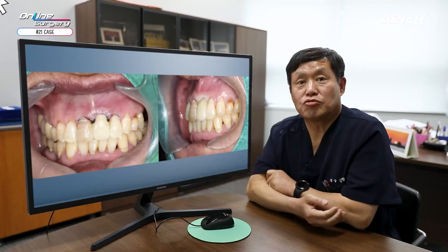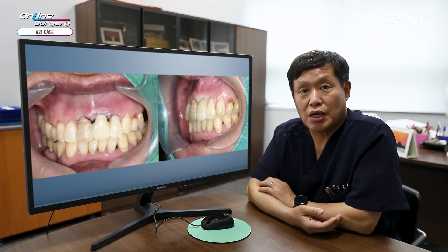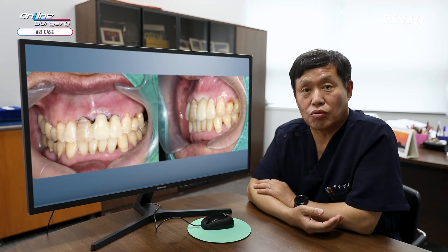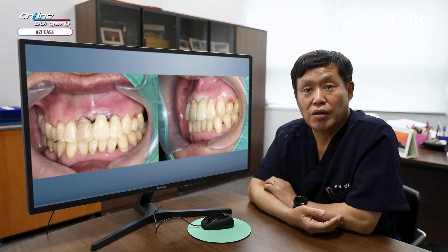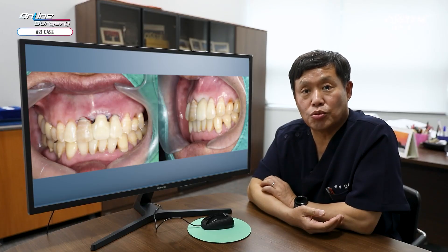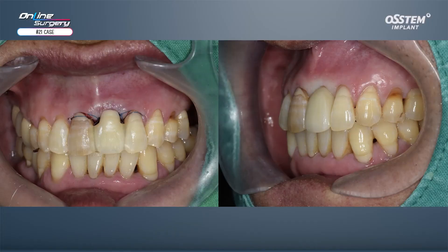As briefly seen in the surgical video, the key takeaway from today's case is that before extracting number 21, the labial bone was completely destroyed while the soft tissue height was maintained. Therefore, we first performed socket preservation and then placed the implant as a secondary procedure. Initially, we planned to place a provisional restoration simultaneously, but due to lower than expected primary stability, we opted for healing. We then performed a dual zone graft with a sufficient amount of AOS Collagen. We used the patient's own extracted tooth as a temporary restoration by bonding it to the adjacent teeth with resin. Looking at the final prosthesis, the gingival height has been well maintained and we used a brighter shade as per the patient's preference.